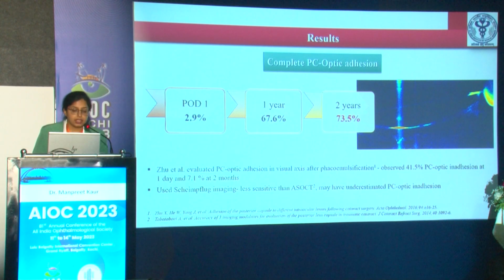At 1 year, this figure increased to 67.6%. At 2 years, it increased to 73.5%. Of note, more than a quarter of cases still had persistent PC optic inadhesion.